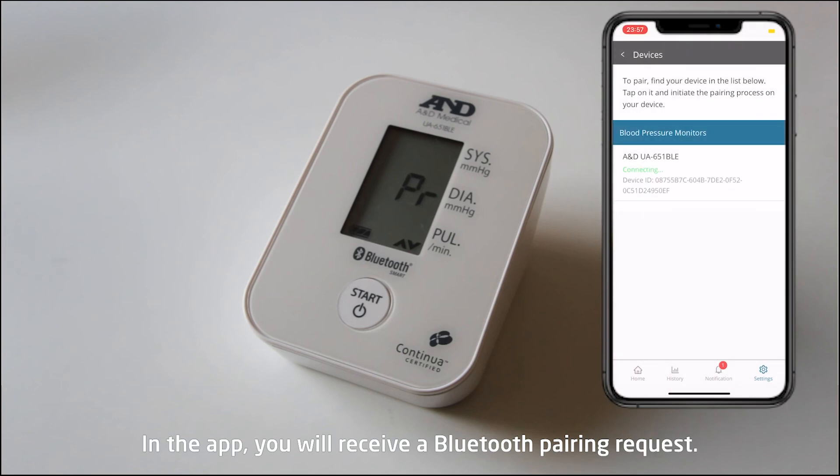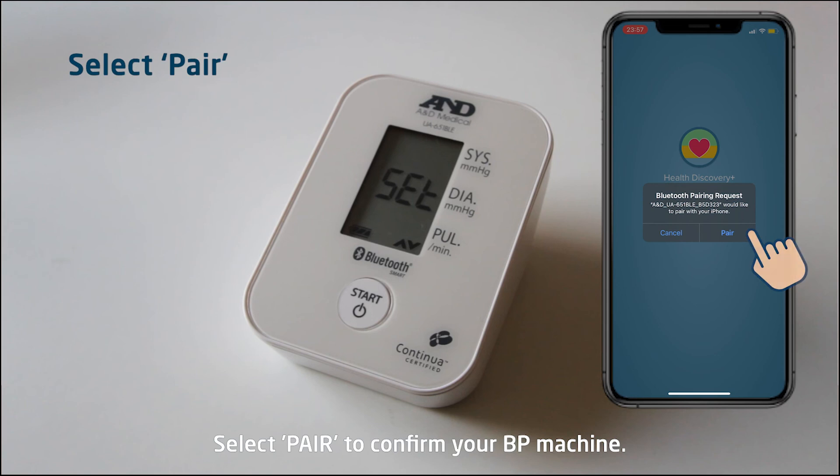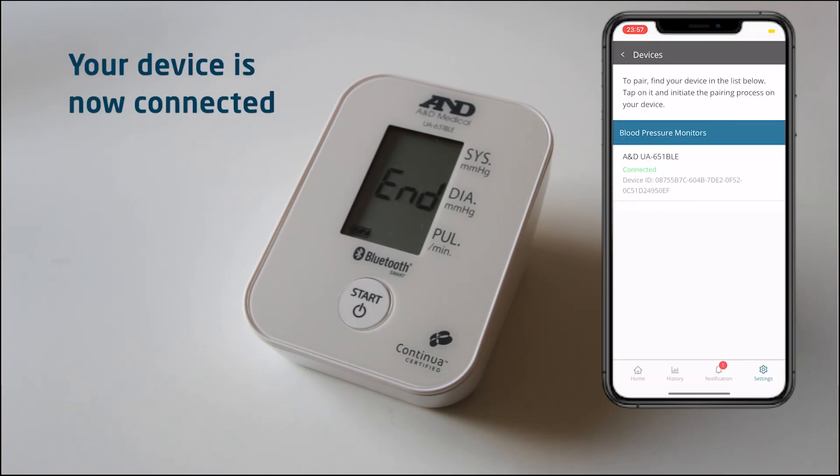In the app, you will receive a Bluetooth pairing request. Select Pair to confirm your BP machine. You are now connected.